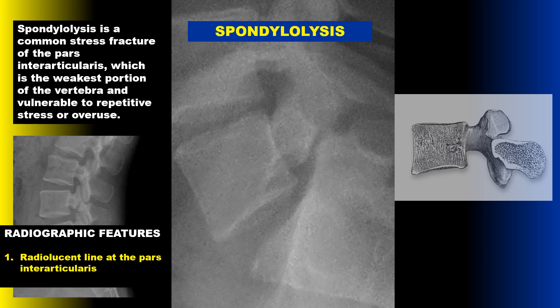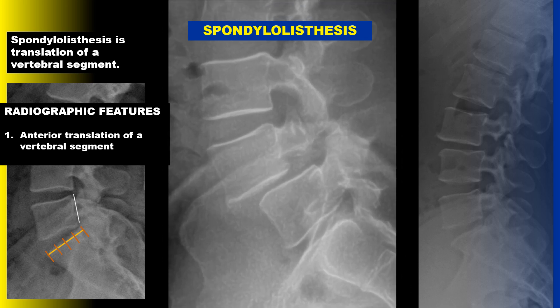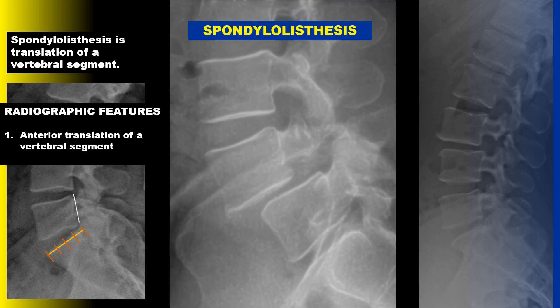Spondylolisthesis is an anterior translation of a vertebral segment. Radiographically, you should see an anterior translation of one segment in relation to the one directly below.